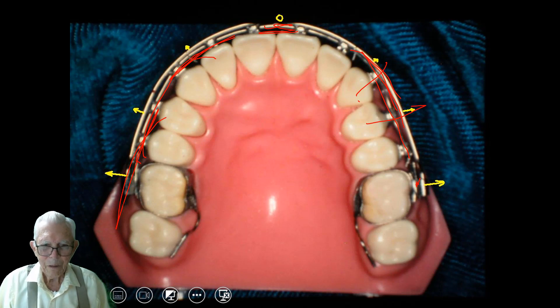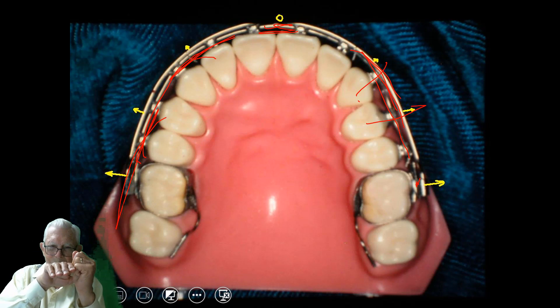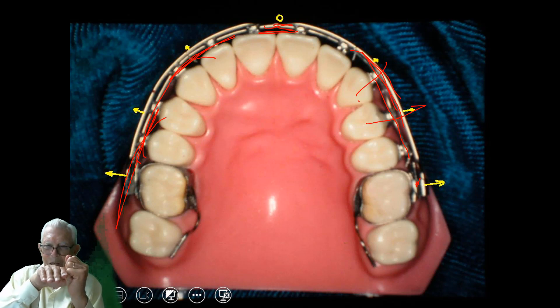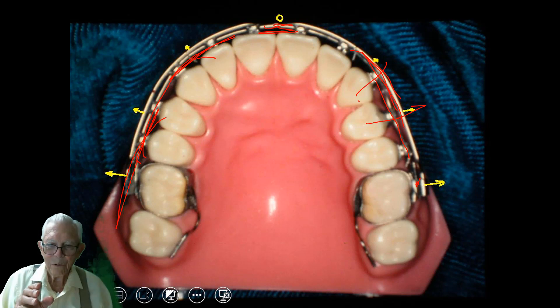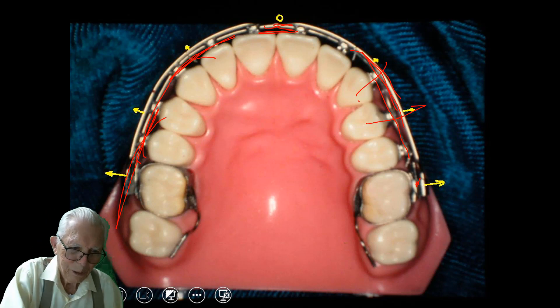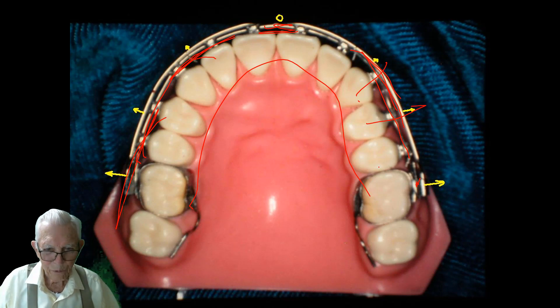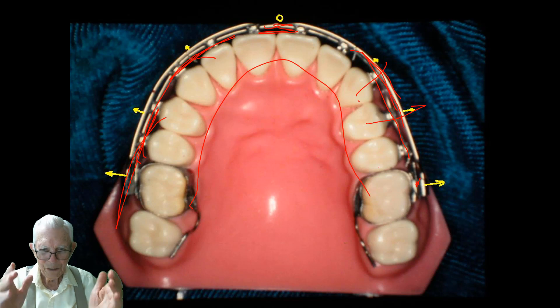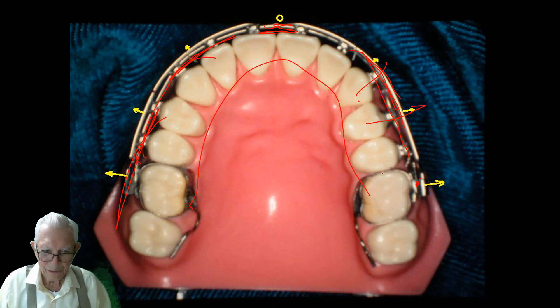It's tricky thinking about it, but you can just look at it like this. If this is a crown and I want the crown of the tooth to go out and I want the roots to go with it, then I do reverse that deal in here. It'll make it look like crown torque, but it would pull that in. So I hope you learned how to use the Big Daddy Arch Wire. I haven't put a lingual arch in anybody for years. It's just a lot harder, and lingual arches down there — you don't have any control of the torque either. You just push the crowns and they lean out like that. You'd have to use a lot of torque on the outside if you're going to use a lingual arch to get it to do the same thing.